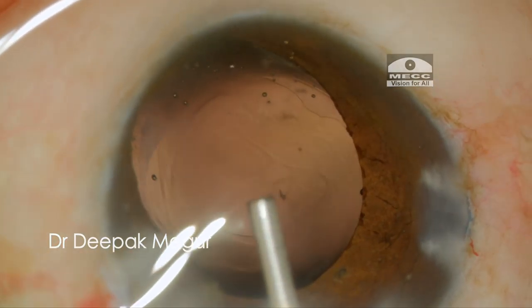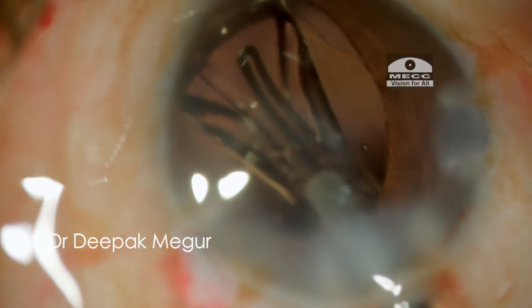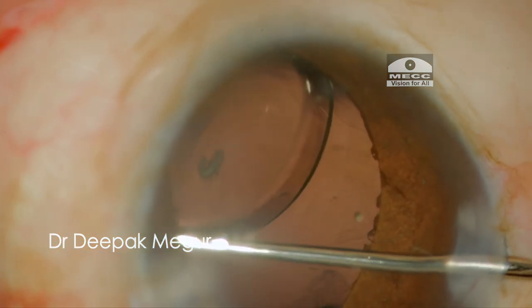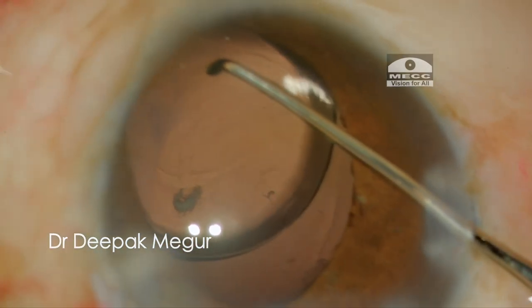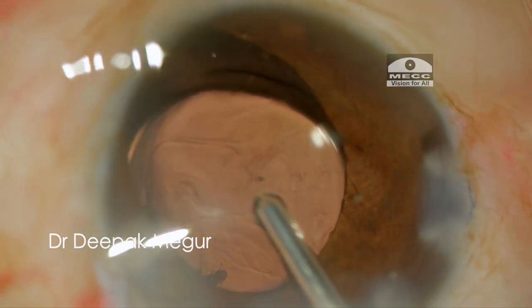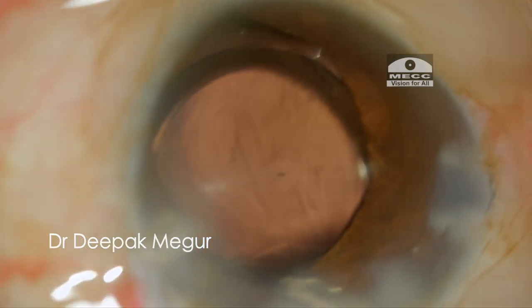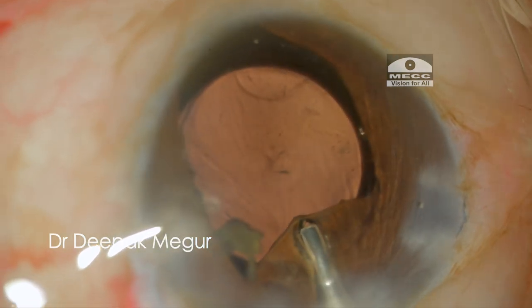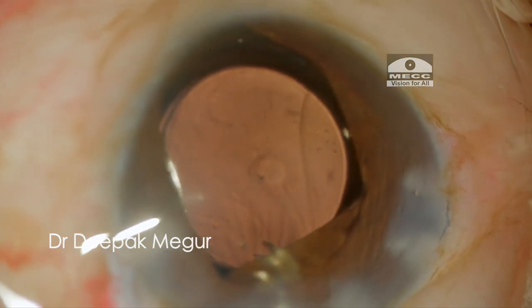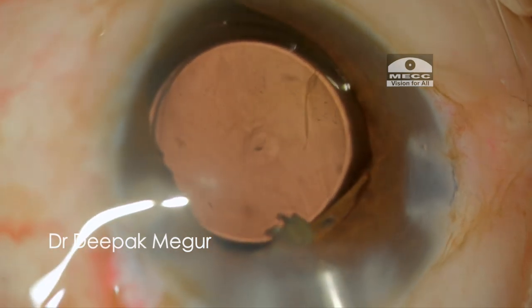After cortex aspiration, the capsular bag is inflated with OVD and a single-piece hydrophobic IOL is placed into the bag. The OVD behind the lens and in front of the lens is gently washed out using gentle irrigation. During all these manipulations, we could see that the PC tear is not enlarged, thanks to the round margins and minimal fluctuations in pressure across the posterior capsule.